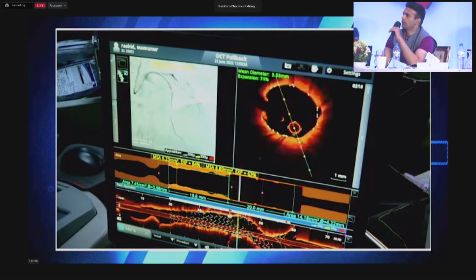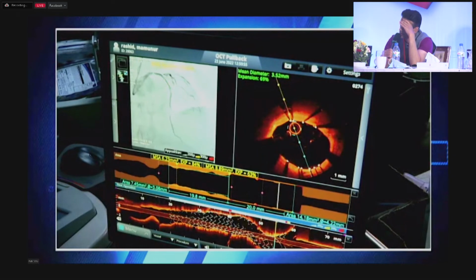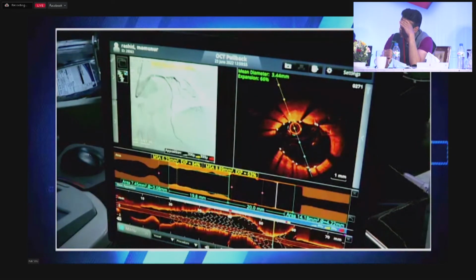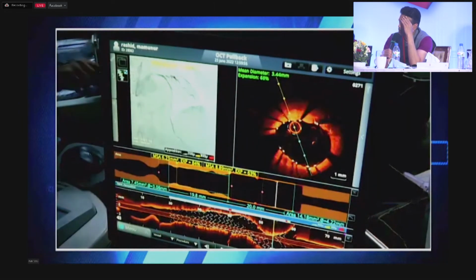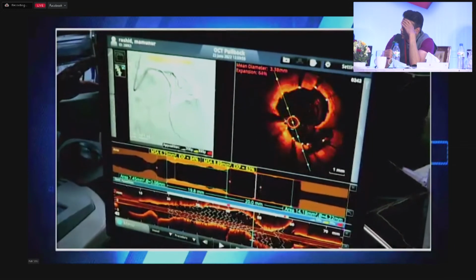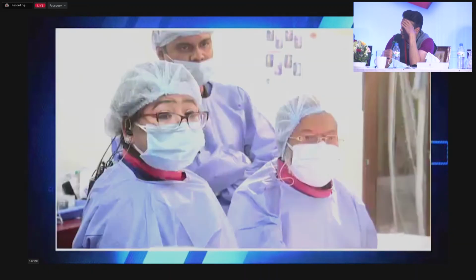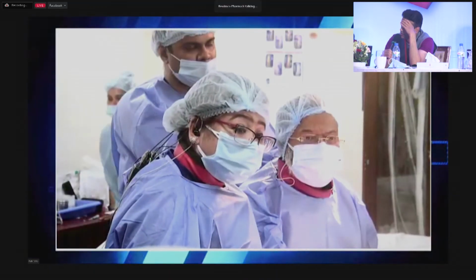Professor Mir Jamal, can you give us an idea of your approach to the plaque prolapse that is present near the distal left main? I'm not sure if that was just a swirl artifact or if there was actually plaque prolapse. Maybe you can scan through the OCT for us there. So the distal left main, show me the distal left main. Keep coming. There. No, come back. Oh, we lost the OCT now.